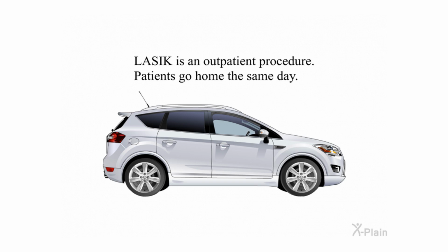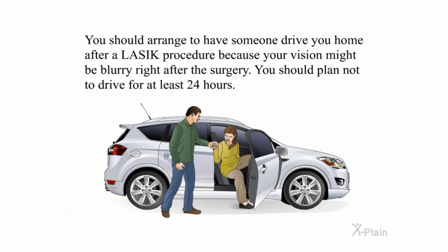LASIK is an outpatient procedure. Patients go home the same day. You should arrange to have someone drive you home after a LASIK procedure because your vision might be blurry right after the surgery. You should plan not to drive for at least 24 hours.